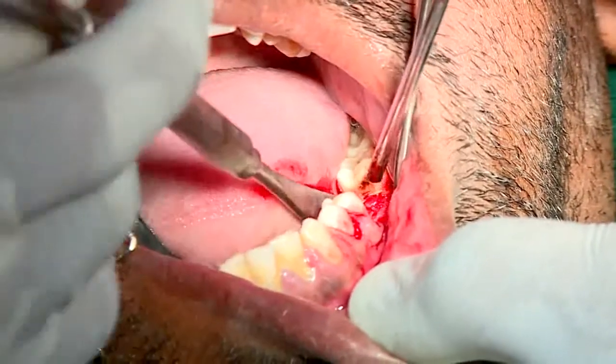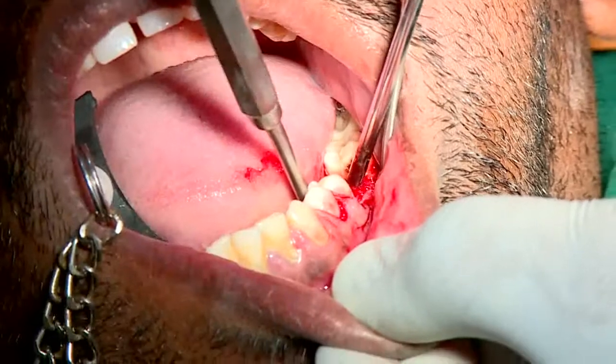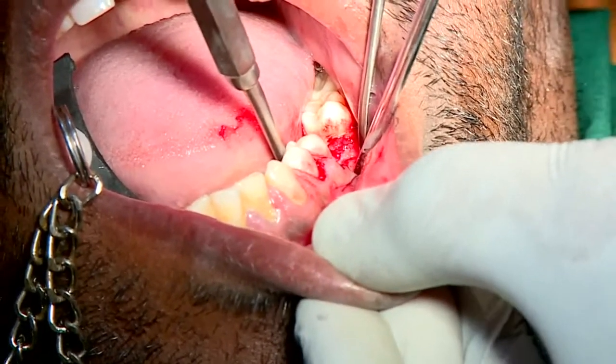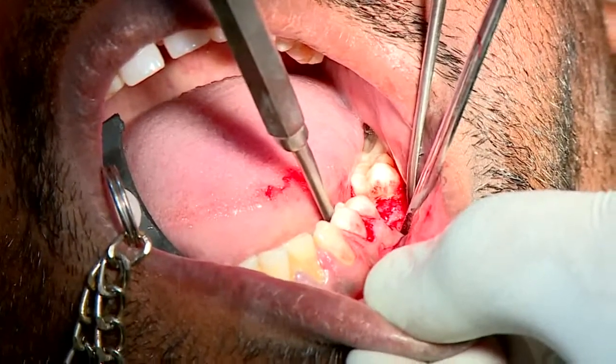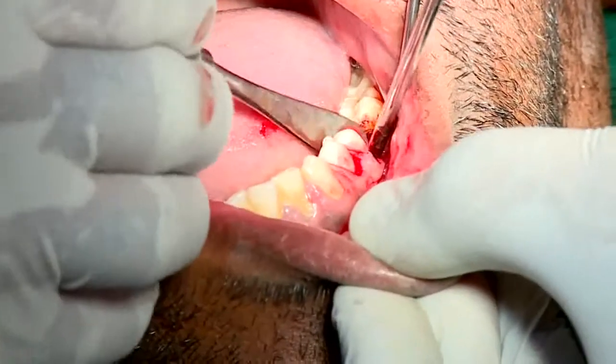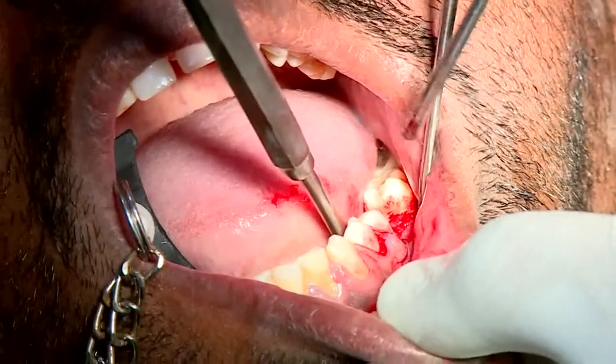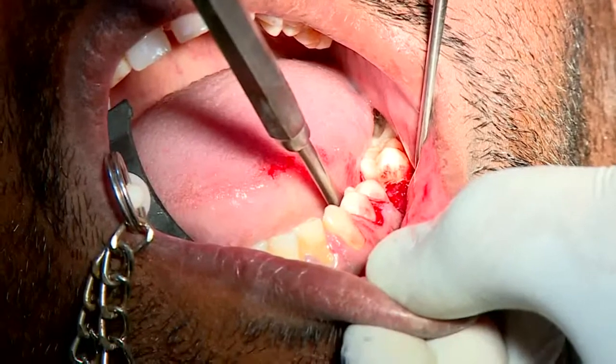So that is the residual bone, guys. Now we have just opened up the flap as a textbook from both the buccal as well as the lingual side. And now you see that at this level, that is at the crestal level, it's still slightly thinner bone. But we can afford it in this particular patient, I will show you the calculation.